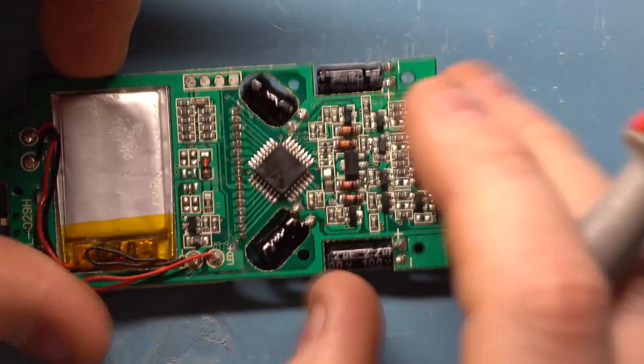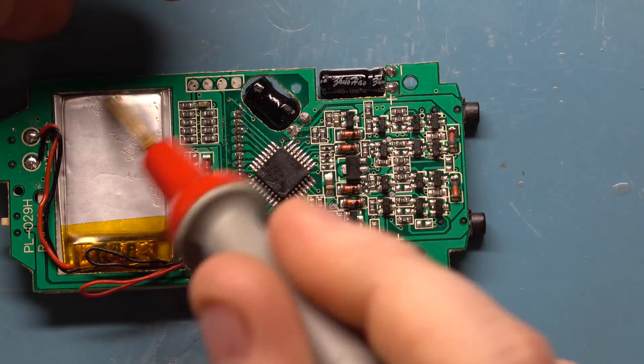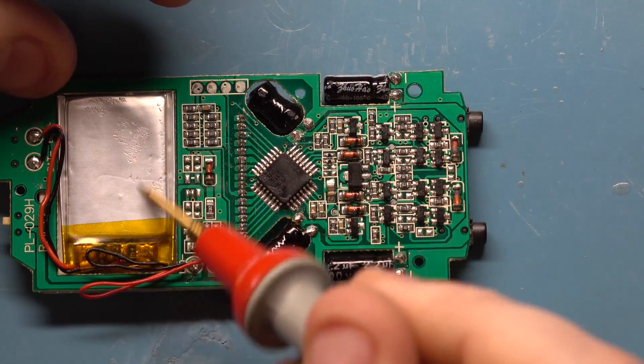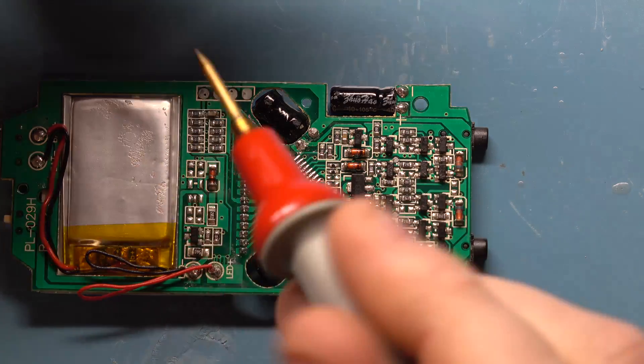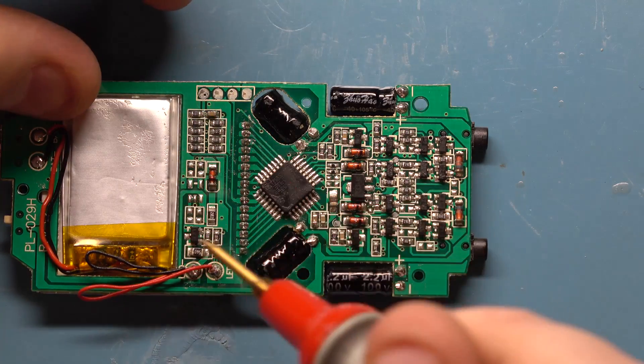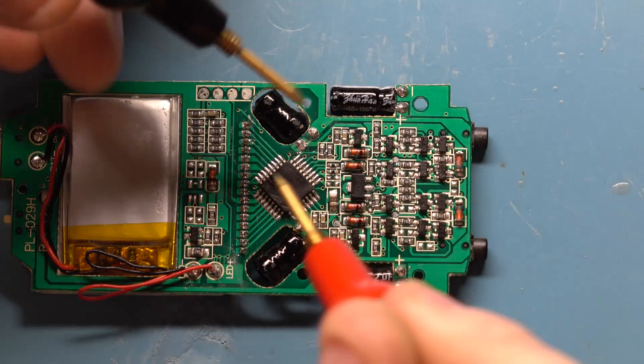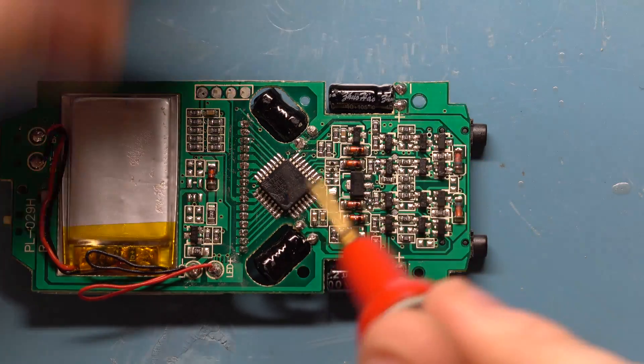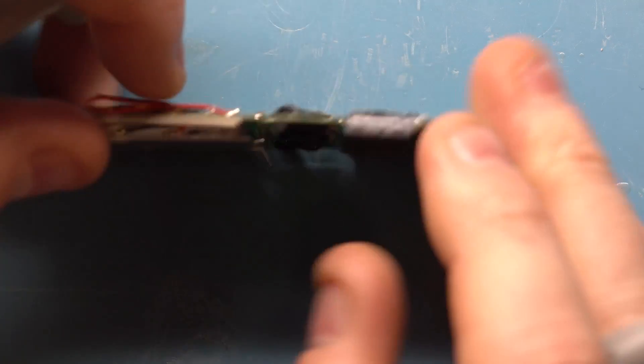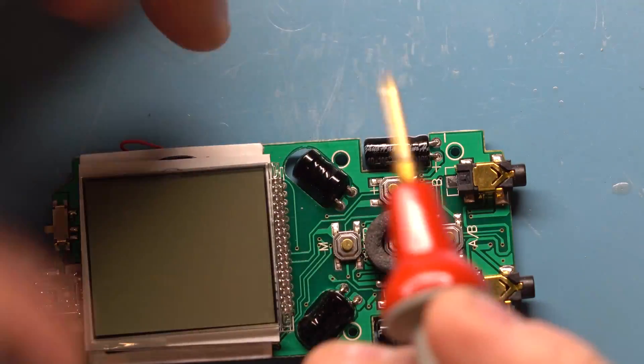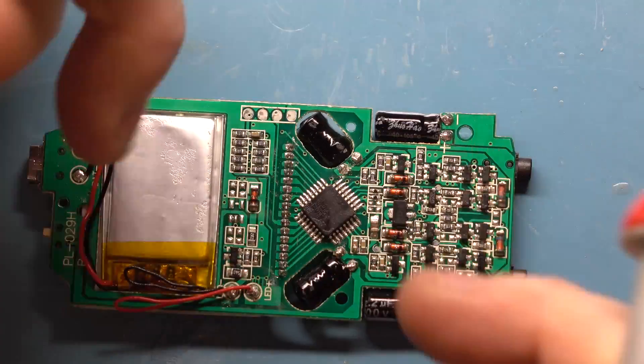On the back side we have the lithium polymer battery and we have the charging circuit up here. This is the microcontroller, and the only reason it is needed is because of the user interface.